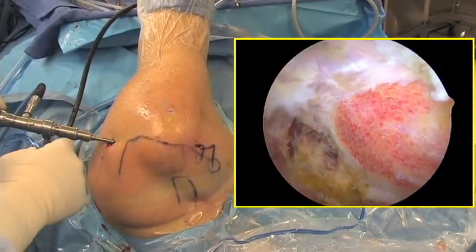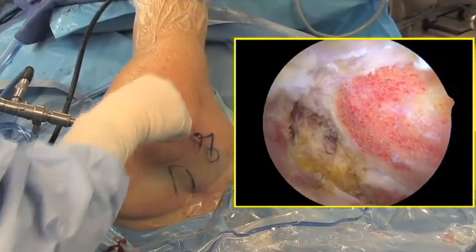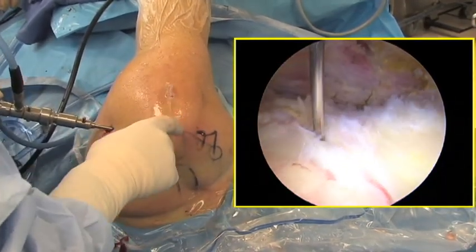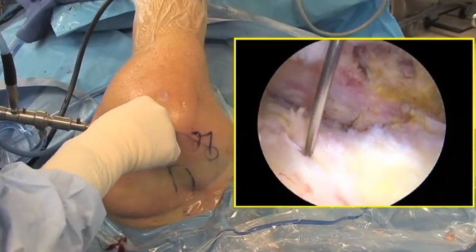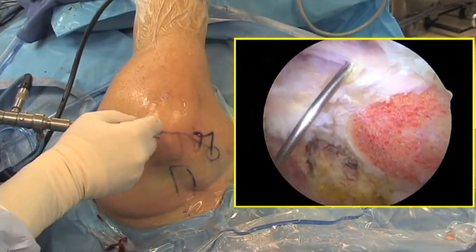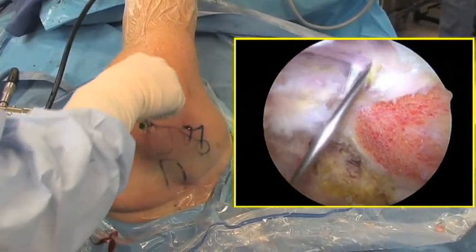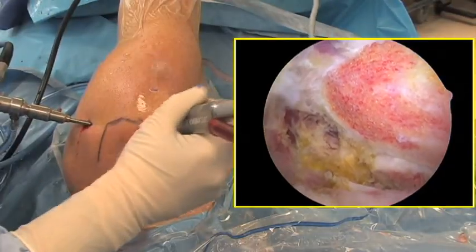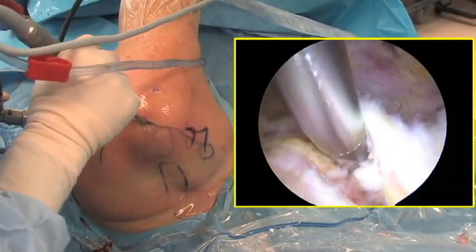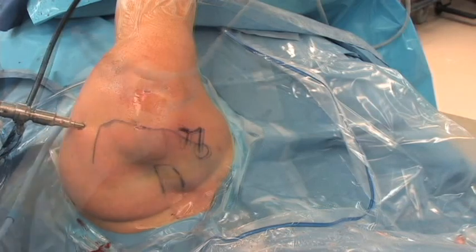The supralateral portal is established next. Its trajectory can be estimated with a spinal needle. This portal should be established between the anterior and middle thirds of the acromion, just off the lateral edge of the acromion, aiming toward the footprint of the rotator cuff, as anchors will be placed through this portal. The skin is incised with an 11 blade and the deltoid fibers are split. An arthroscopic shaver is then used through this portal to further prepare the undersurface of the rotator cuff tendon and decorticate the footprint of the rotator cuff. Bleeding bone is exposed to which the rotator cuff can heal.